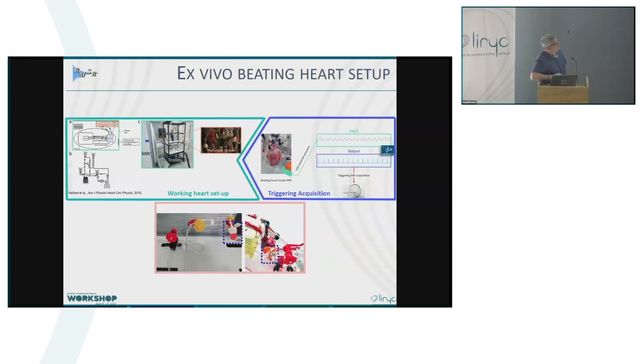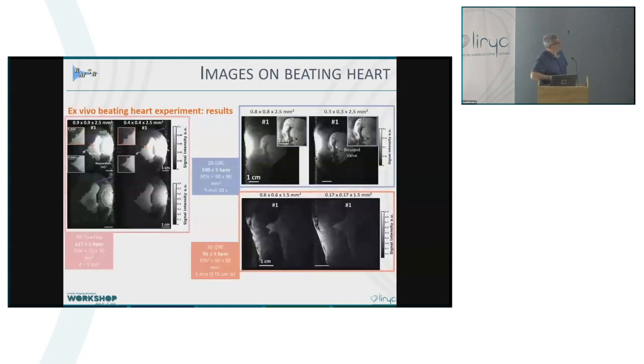So what ideally in vivo? The intermediate step was to exploit a device that we developed a few years ago. This is on this trolley. You can put some equipment and do surgery on a pig or a sheep, collect the heart as you would do for cardiac transplantation, then resuscitate the heart and make it beat inside the MR scanner. You have a photograph here with the heart, and you can attach the coil to a holder and position it next to the heart and do acquisition.